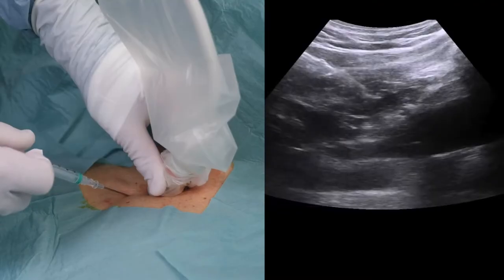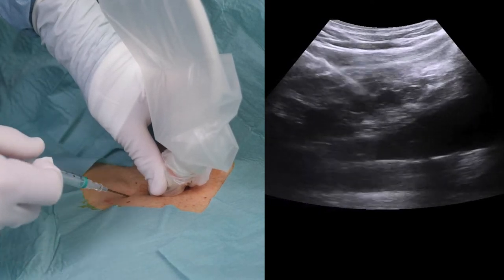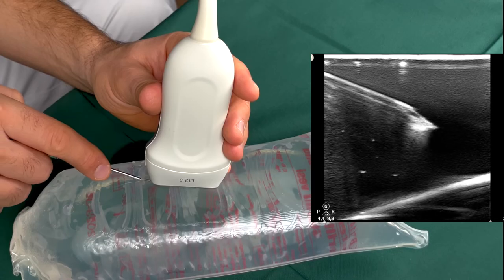By shifting laterally, we can make the tip reappear. Now this is how not to do it — you may find the tip, but you'll lose your alignment. The in-plane long axis technique has the advantage that it inherently leads to a shallower angle of approach to the vein. This is vital for several reasons. Due to the physics of ultrasound, it makes the cannula appear much more distinct. It also facilitates a clean puncture, as it reduces the risk of perforating the posterior wall. The shallow angle also reduces the risk of kinking the guide wire, and subsequently the catheter. So go shallow.